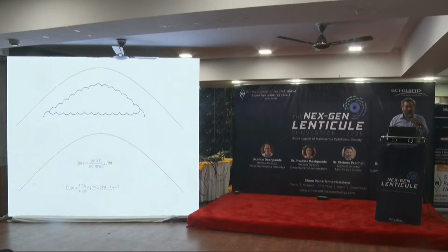Not only the pulse, we learned how to calculate the power, and we learned how to calculate the dose. So dose and power, again, the energy, are different things. Okay, we'll come to that slowly. I think first you understand only the pulse. All right, so this is the formula for your dose. This is what you created.